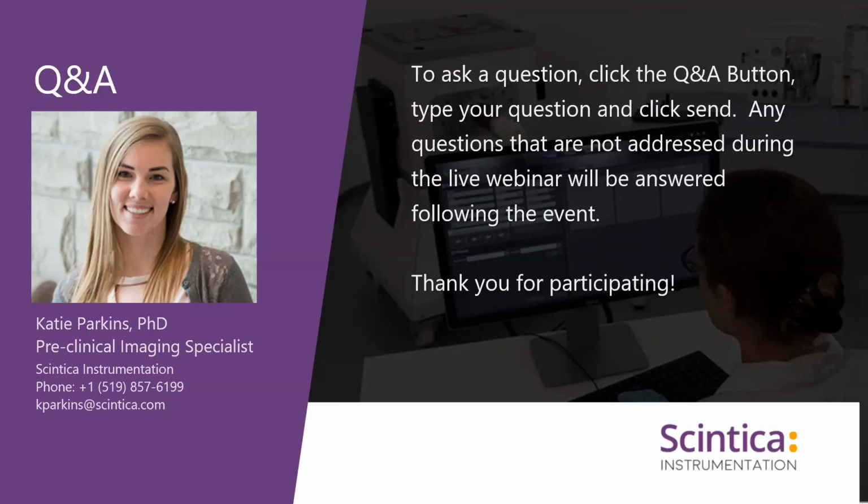It gets a little bit confusing because people can also say simultaneous multimodal. So that would be something where we have an integrated system such as PET MR. And I would say that would be multimodal rather than multiplex.